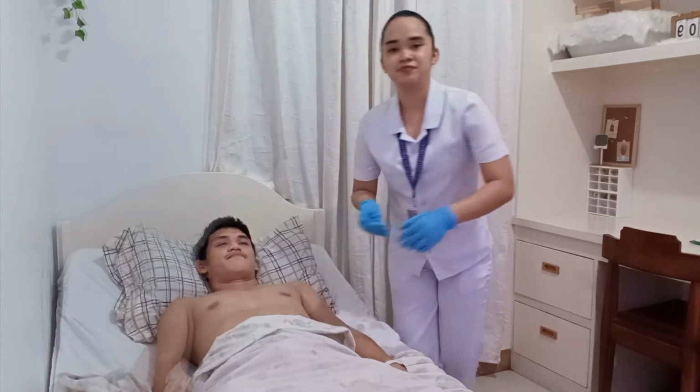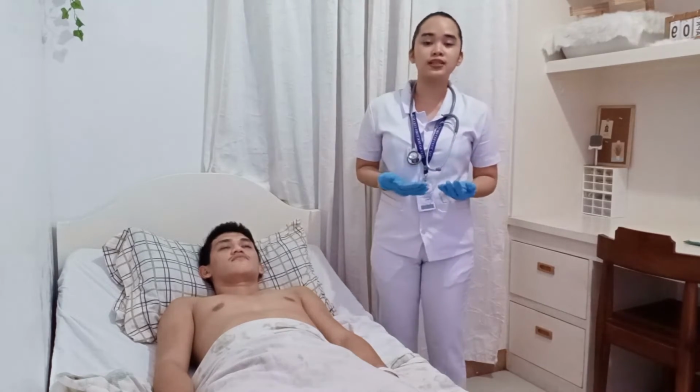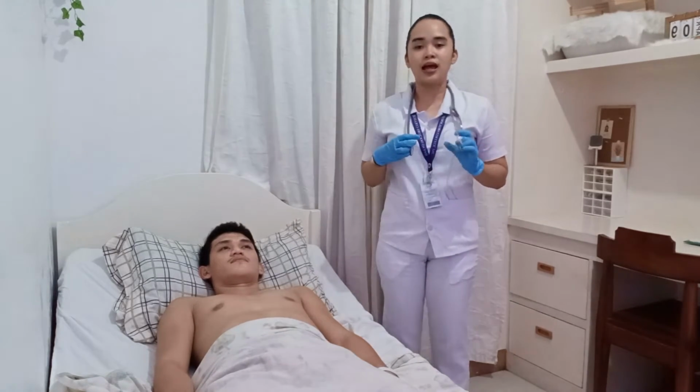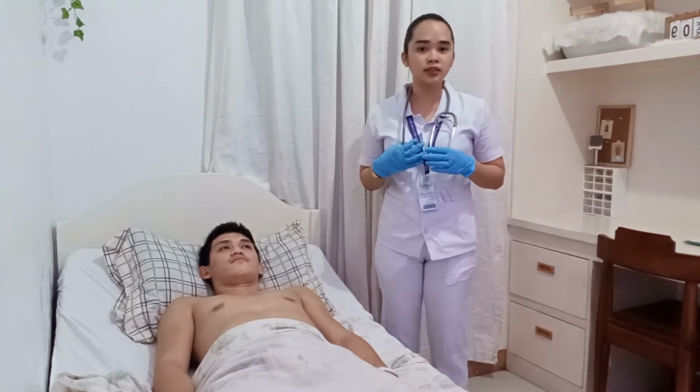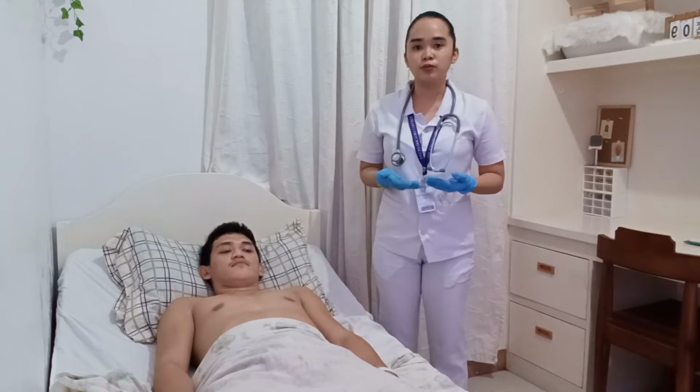Okay. For the auscultation, assess for heart rate and rhythm by placing the diaphragm of the stethoscope at the apex and listen closely to the heart and rhythm of the apical impulse. Count the heartbeat for a full minute, and if an irregular rhythm was detected, assess for a pulse rate deficit.